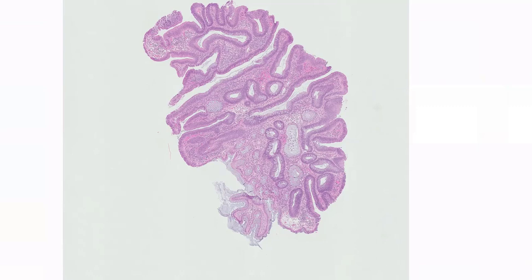When I look at tubular adenomas, I often look at them on low power, and what I'm looking for is very blue-looking epithelium on the top. I'm also looking for these contrasts — something I'm going to talk about over and over again — looking for a crypt that looks atypical, right adjacent to which there is a crypt that looks not atypical at all, looks like a normal colonic crypt.